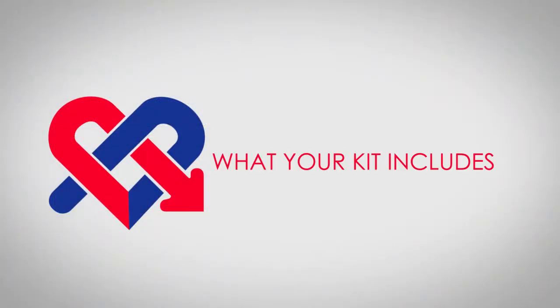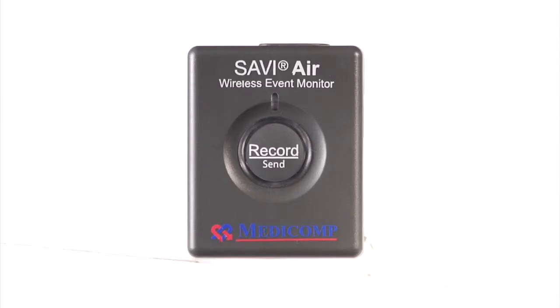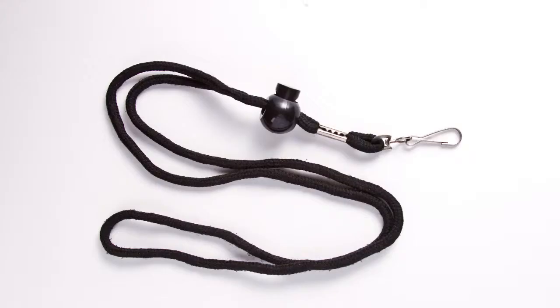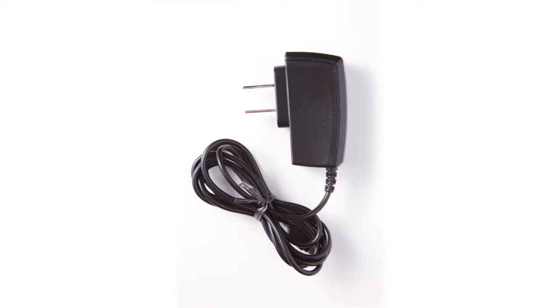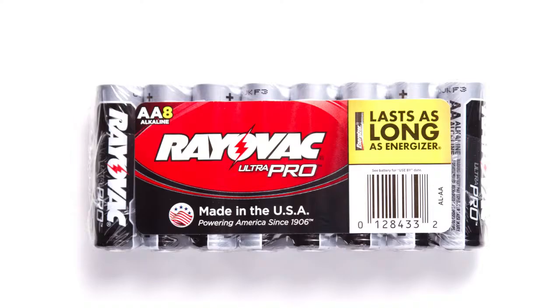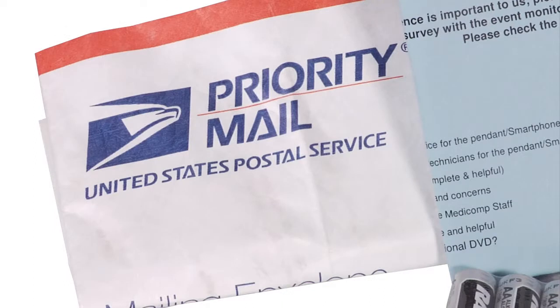What your kit includes. In the kit you'll find the following items: Savvy Air Pendant, Medicomp Smartphone, Pendant Belt Clip, Lanyard, Smartphone Holster, Smartphone Charger, Patient Cable, Electrodes, Double A Batteries, Patient Survey, and a prepaid return shipping envelope.